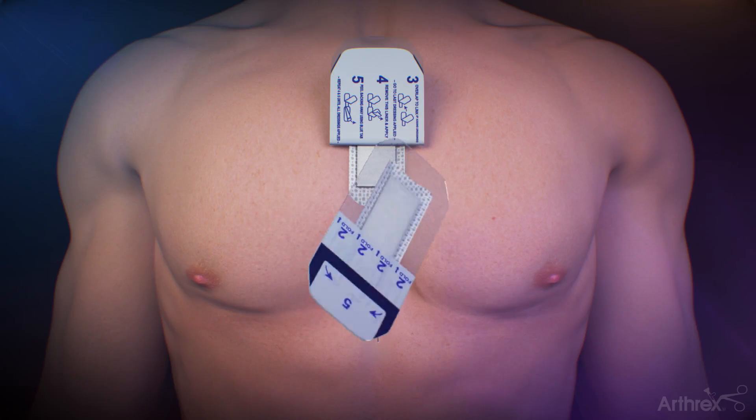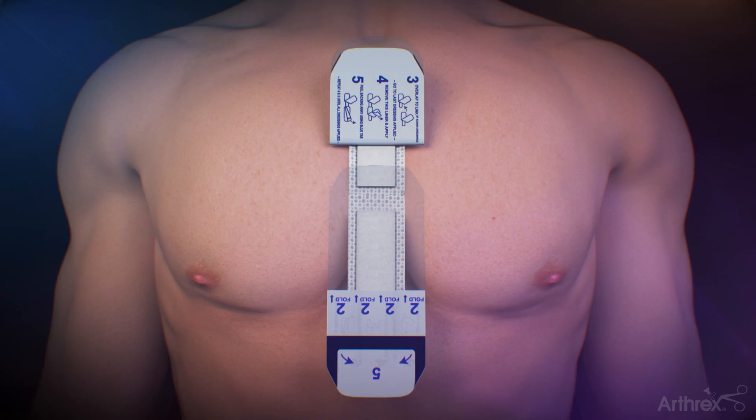Make sure to press down gently on the dressing to ensure direct contact of the microcell battery dot matrix with the incision. The previous steps can be repeated as many times as necessary until the full length of the incision is covered.